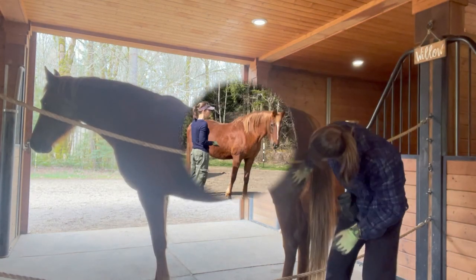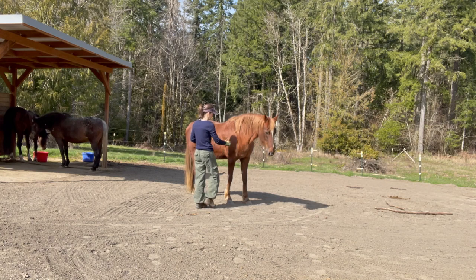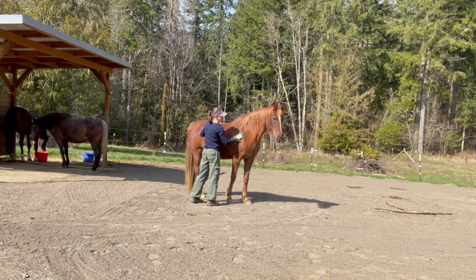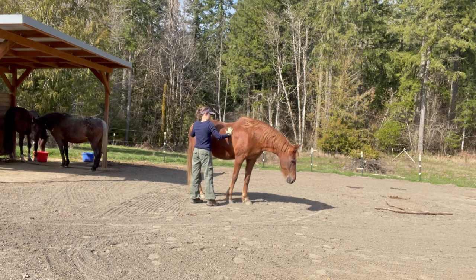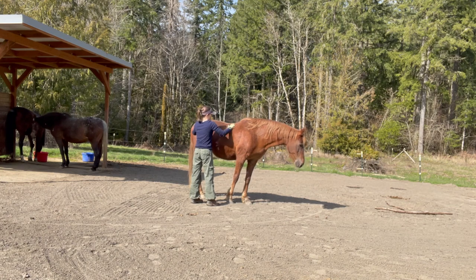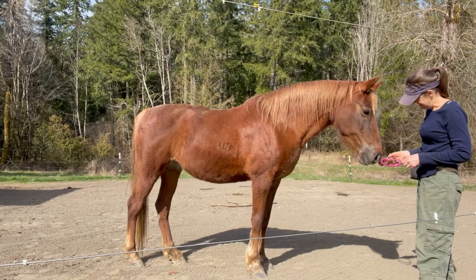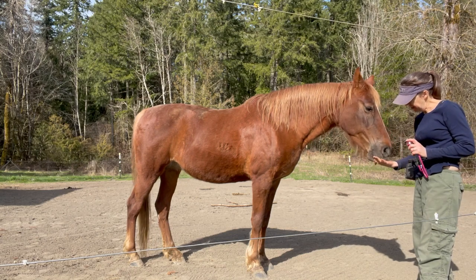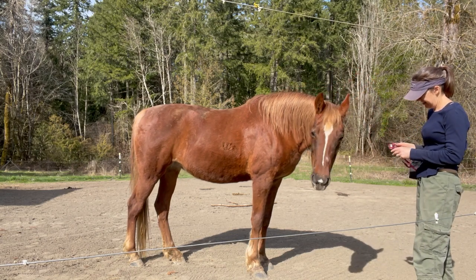Then we progressed to being out in the open paddock. We got lucky because it was spring so she was super itchy. You'll notice I still don't start right behind her elbow — I start all over her back and get her comfortable first.